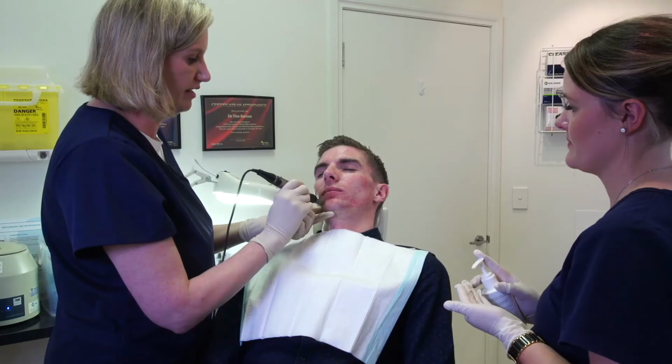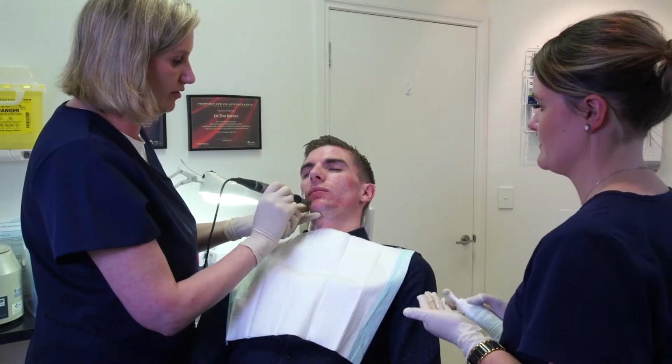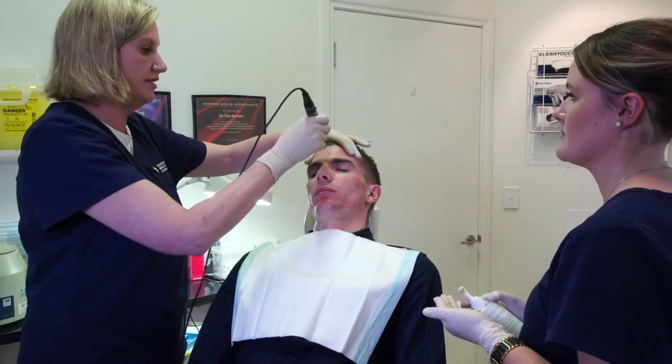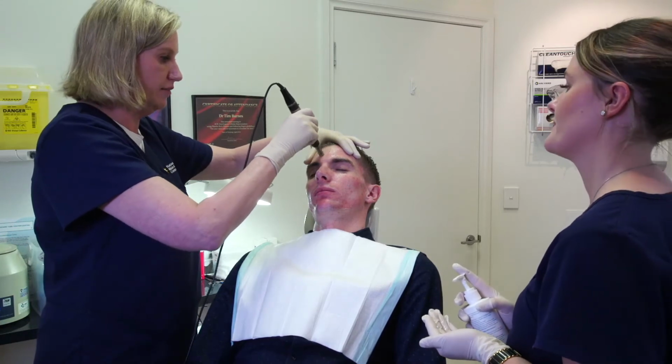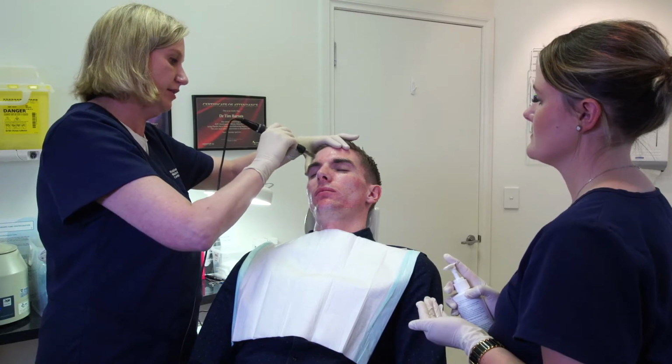So you can see where the active little papules are, there's a little bit more pinpoint bruising. Warn the patients that in the areas where there may be some scars, they'll notice the bleeding, the microhemorrhages, is a bit more obvious, but that's fine, it'll settle down after about 48 hours.